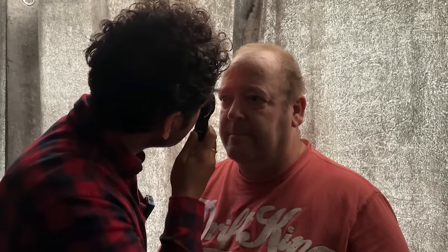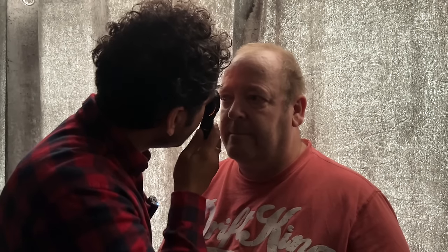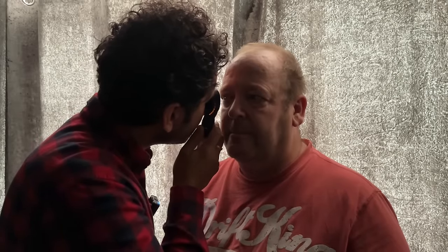And if we bring it down to the smallest aperture, we can ask the patient to look into the light and focus on the fine vision area — the macula. When we're looking at the macula, just want to be careful of the brightness of the light, to avoid blinding the patient too much.